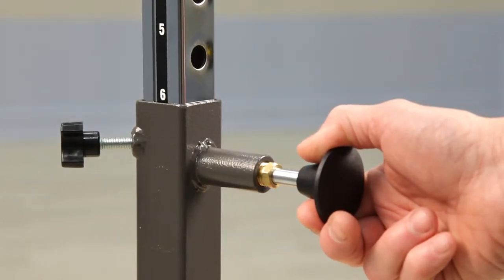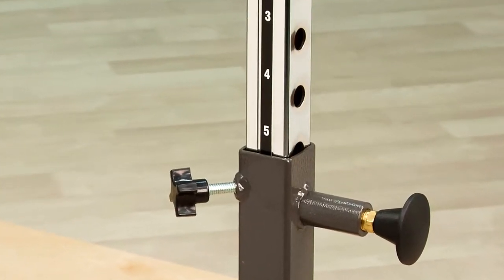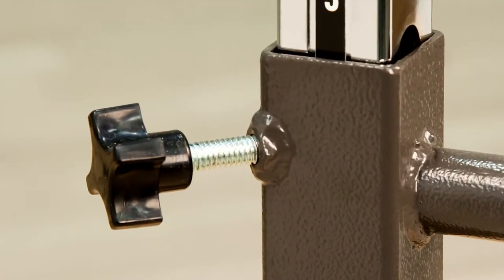Adjust the height of the handrails with the spring-loaded plungers, which are clearly numbered so both ends and both bars can be set to any height quickly and easily. An additional adjustment knob makes certain the uprights are tightened into place, removing side-to-side play.